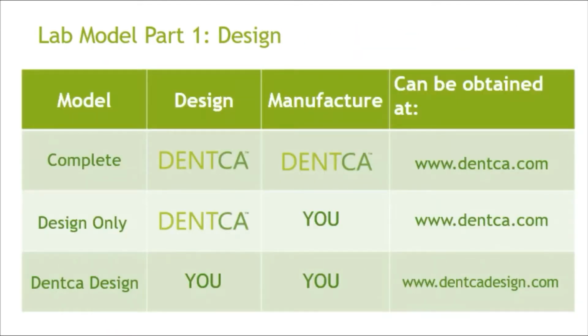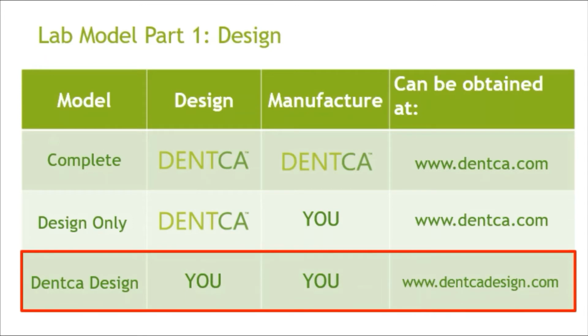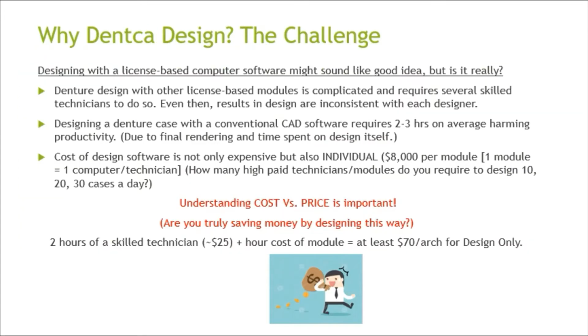If you're interested in manufacturing and designing yourself, you can design using the DENTCAdesign.com software. The DENTCA Design software allows you a lot of freedoms. One of them is the fact that it's not a license-based computer software.